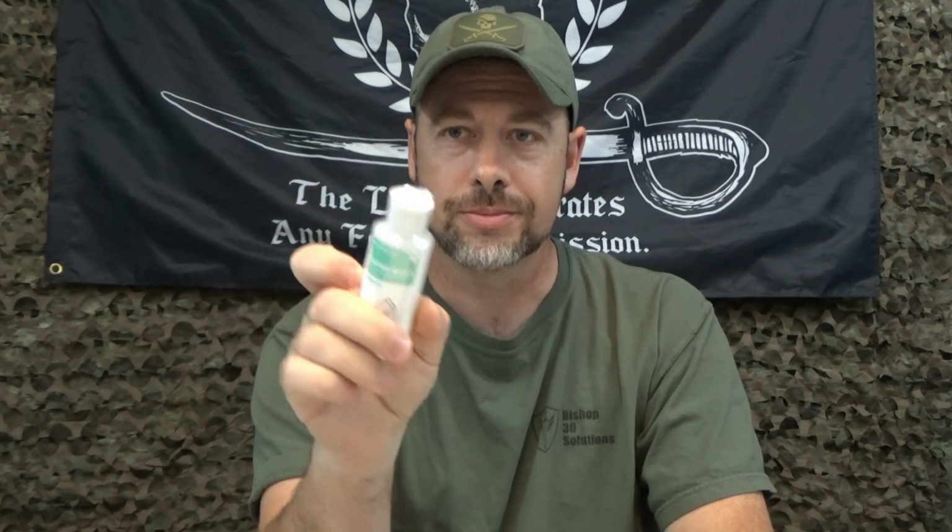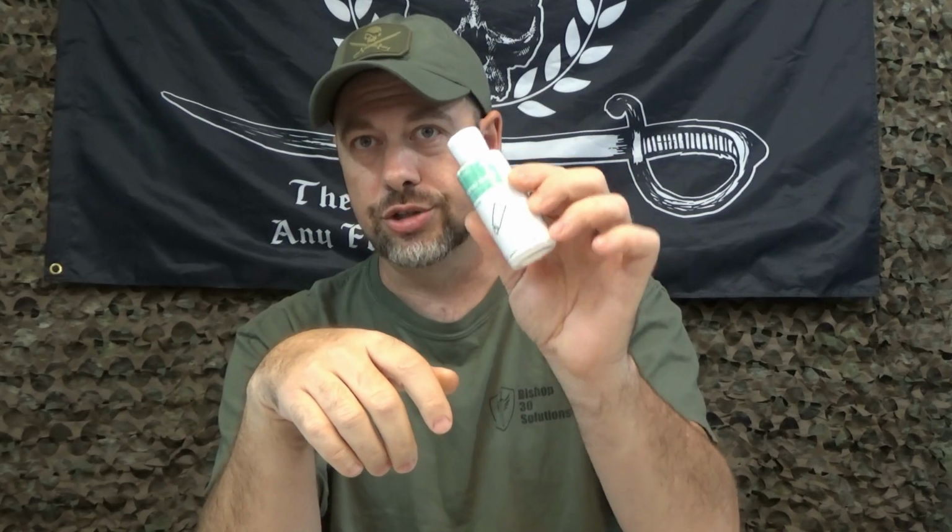Then you get a little bottle of what they call a super wash. It's basically just like a saline solution. You can use it to disinfect a wound. You can use it if you get something in your eye. I really like that for this because it's got the little flip up squirty thing on there, and you can squirt it, flush your eye out, get dirt, foreign object, whatever out of your eye. Good, handy, simple thing to have that not everybody thinks about. And with this bottle, if you can get saline solution in larger quantities, you can refill it if you need to.